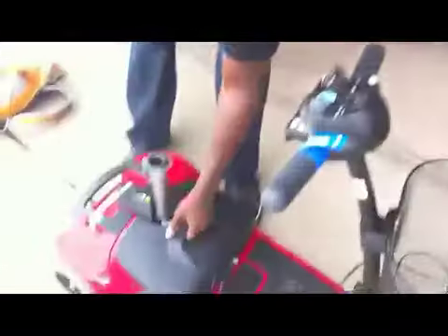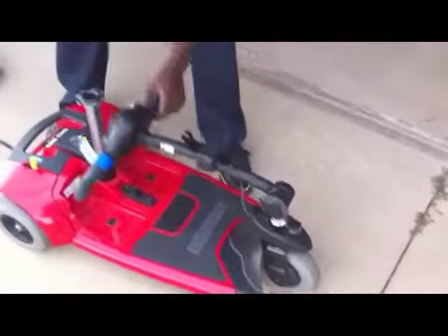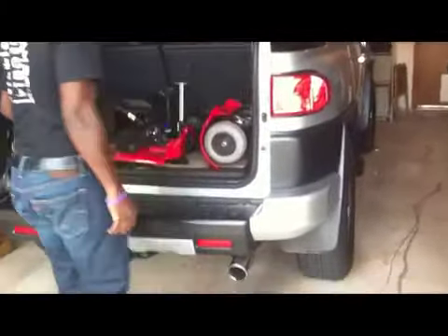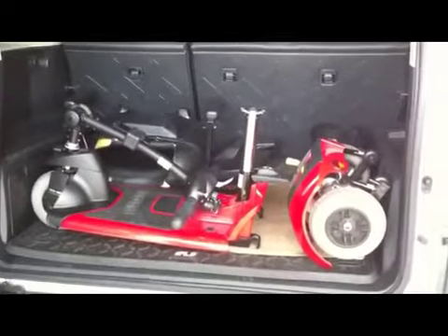So Duane, this is how he does it, because it's too much for me to do. At one point I could do it when we very first got it, but it was really hard. That part folds down, and I just take the front off. And there it all goes — it fits in the back of the car. As Duane said, it will fit easily in the trunk of a car also.